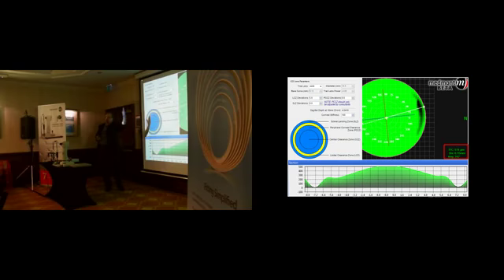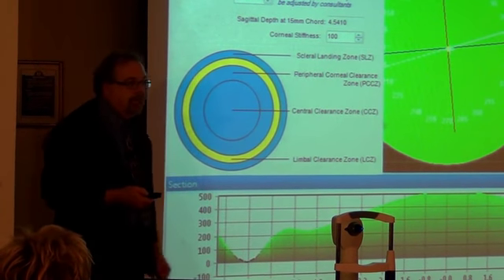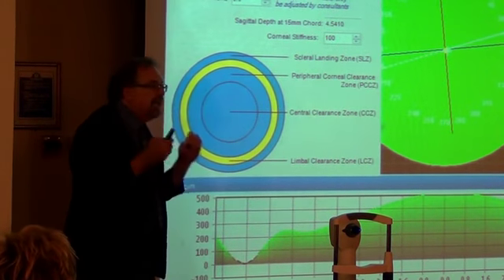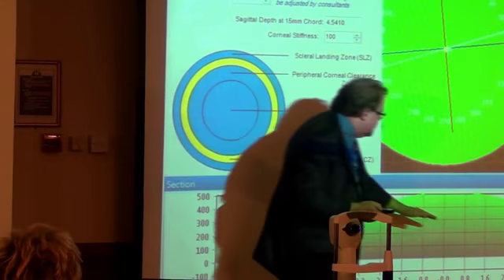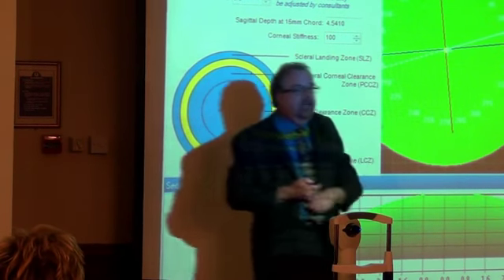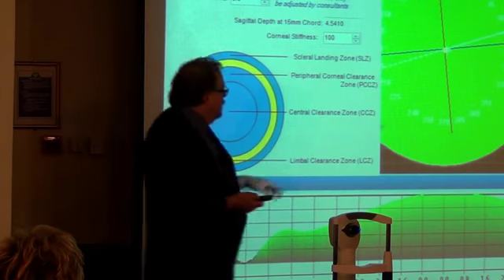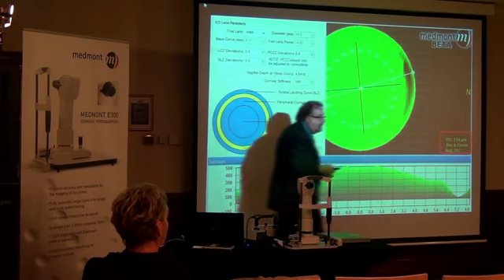It picks it up 5 degrees, and now we have significant clearance out there. However, what did we say? We said when we change that angle and lift it up 5 degrees, we increase the sagittal height of the lens an additional 125 microns. So now we're at 514 microns.